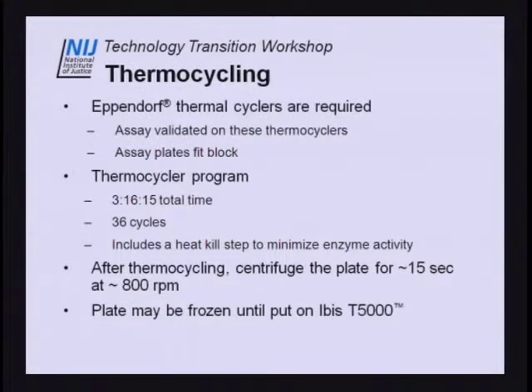You can freeze the plates before putting them on the IBIS T5000 if you're ever in a situation where you're thermocycling faster than you're running on your T5000. And as we discussed a little bit on the tour, you can probably do that for about a month, freeze your PCR plates before running them.